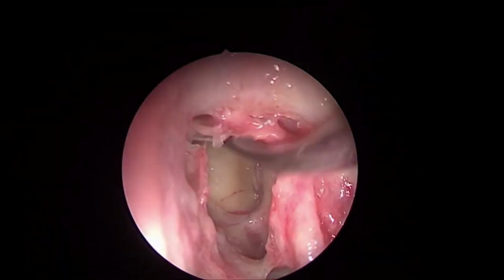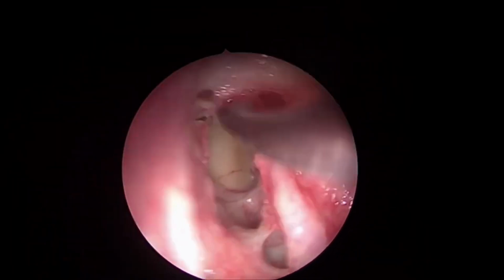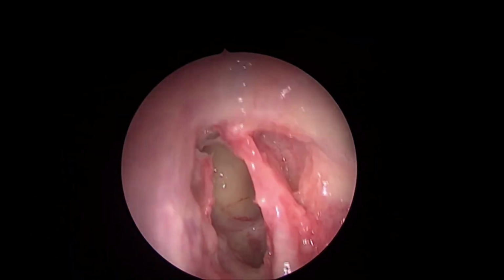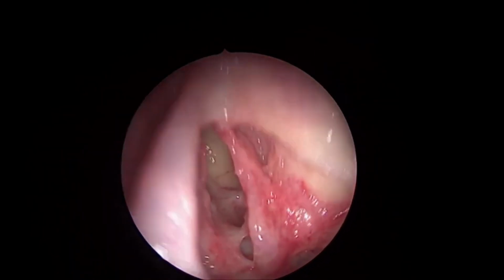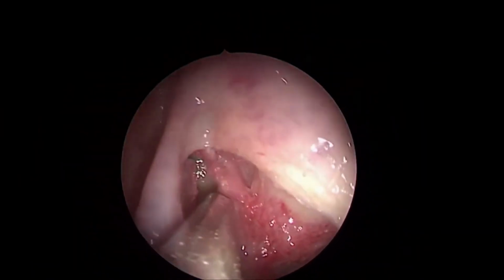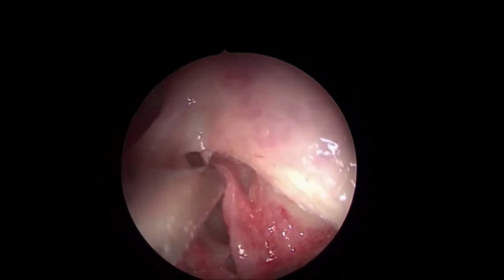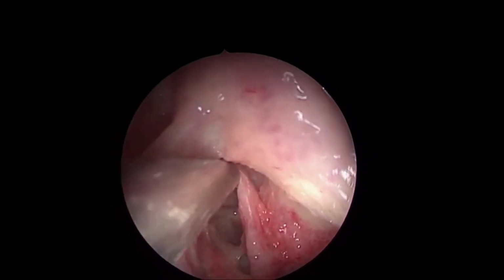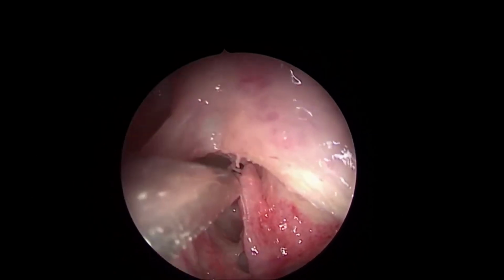Sir, when you're in this region and when you're using the 70 degree, I would request if they can also show the PIP of all your external maneuver that you're doing with the 70 degree scope. That will be very helpful for everyone. My scope is parked close to the columella, pressed to the columella. So my left hand is almost immobilized.